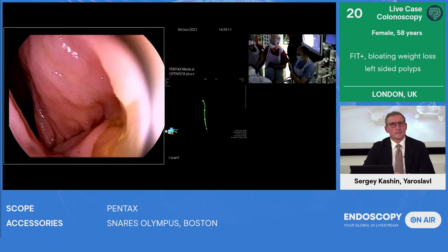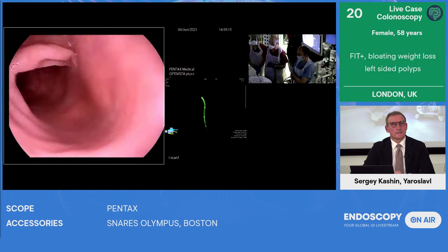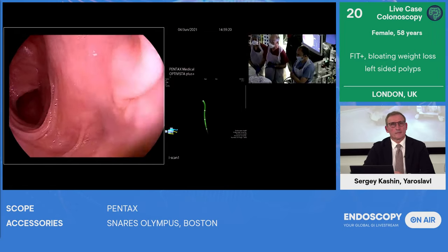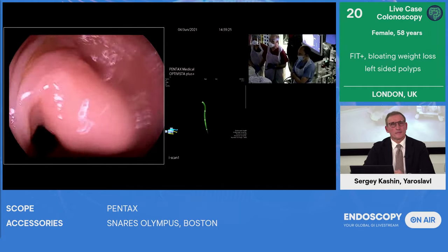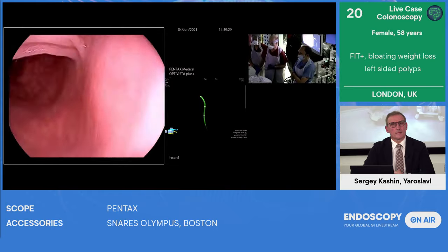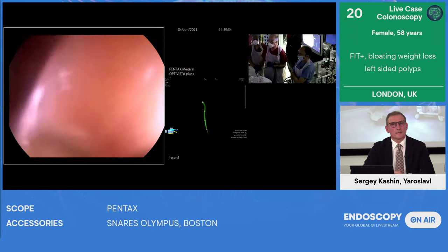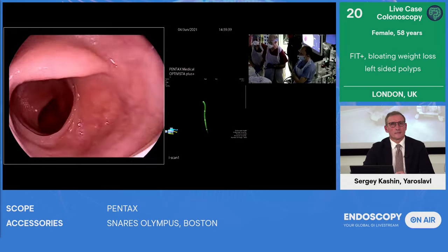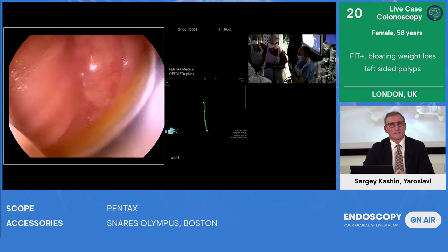The AI will never make those decisions, though it will be a good guide, I think, in the future with characterization. And it'll probably come in post-therapy. Looking at the EMR or ESD defect will be really useful, I think, to give us ideas about risk of bleeding. Should we close the entire defect with clips? Should we apply one of these hydrogels to help with healing? Is it a complete excision?